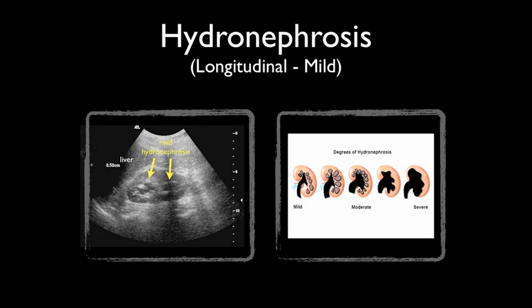As you can see from this renal ultrasound, the central portion — the medulla — has multiple dark areas that could be confused with cysts. But upon fanning the ultrasound probe, you can actually see these structures coalescing to form dilated calyces. Comparing this ultrasound to our cartoon rendition, you can see that the image represents mild hydronephrosis.